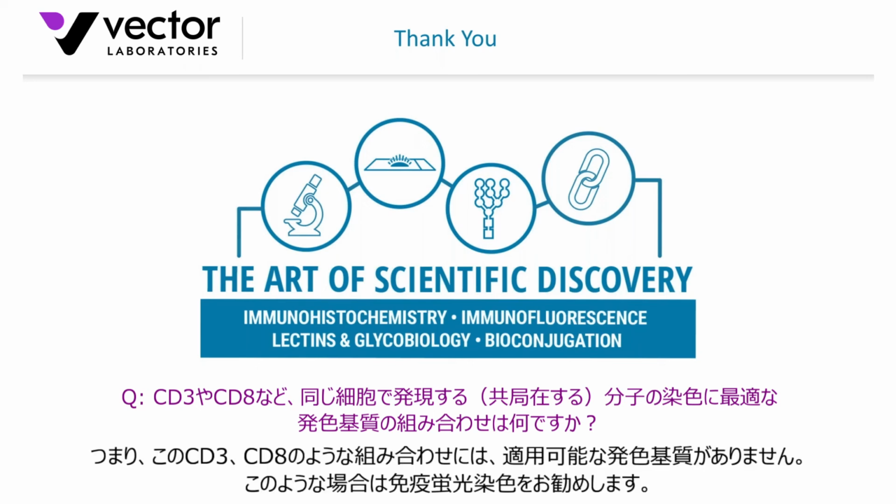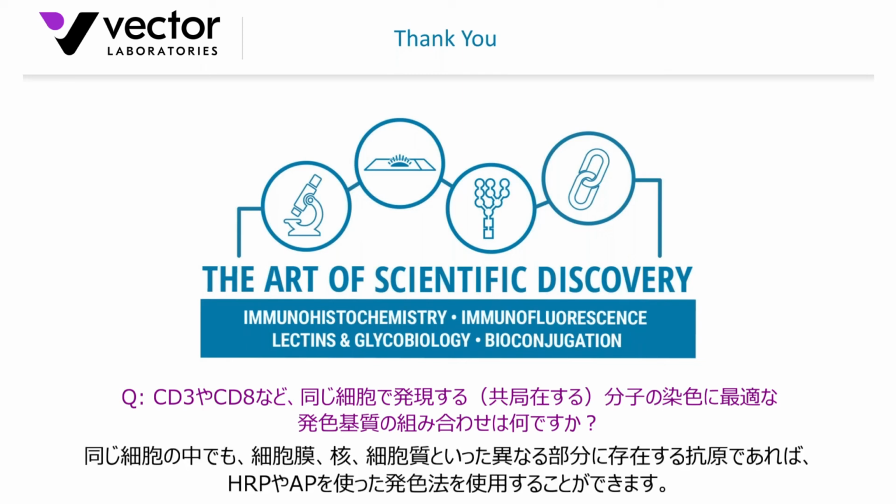So if you do face that scenario of CD3, CD8, what color combination would work well? I don't think I've got one that would work in that given scenario using the chromogenic methodology. You would probably have to go with a fluorescence-based system. What I will say, though, is if you do have two closely opposed or adjacent target antigens in the same cell, maybe one's membrane-based and one's nuclear-based or cytosolic, you could certainly use a combination of peroxidase or alkaline phosphatase-based substrates there.